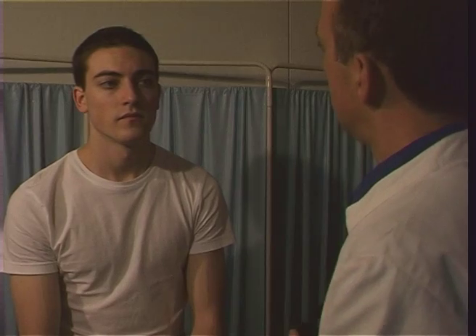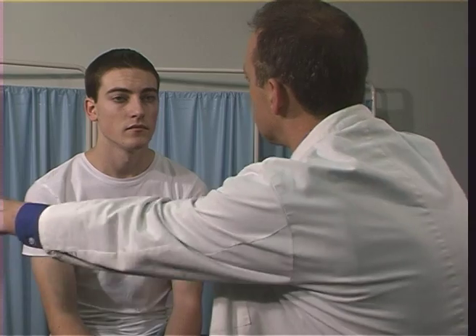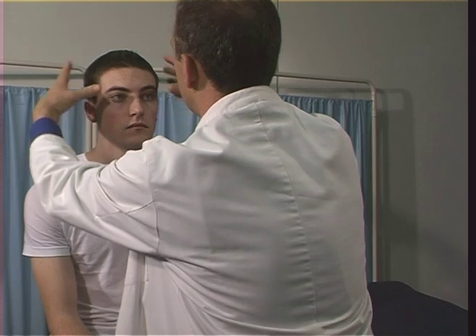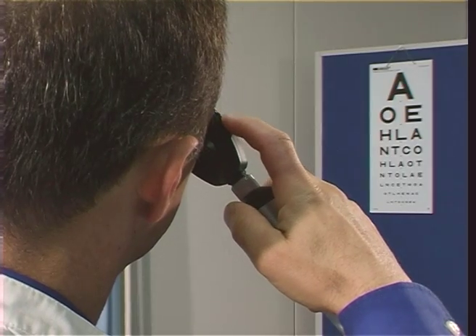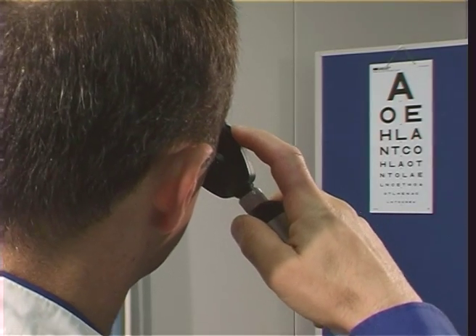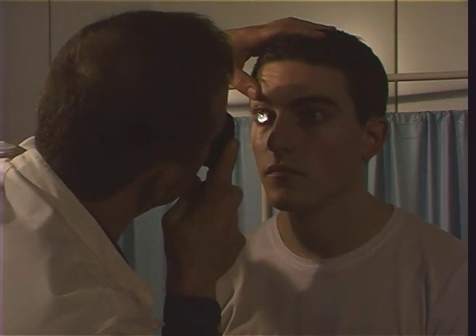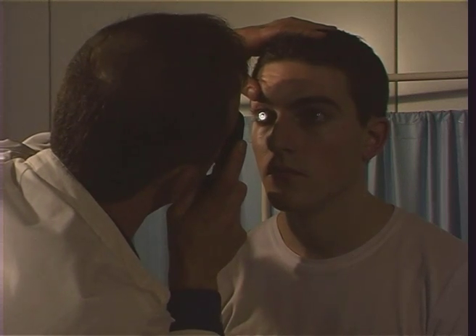Instruct the patient to look slightly laterally over your shoulder and to focus their gaze into the distance, preferably on an object on the wall. You may wish to examine first the external features of the eye, including the eyelashes, the lid margins, the sclera and conjunctiva. Begin at arm's length using the widest beam, setting the diopter to zero or at the setting calibrated for your vision. Hold the handle slightly to one side away from the patient's face and keep your index finger on the wheel of the lens so that lenses can be changed easily.